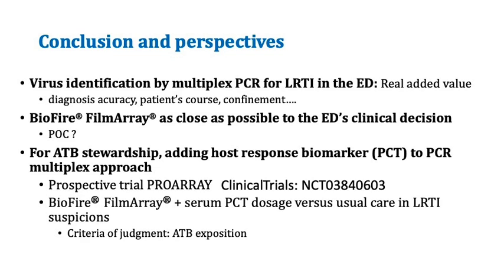So, what are the conclusions and perspectives? First, virus identification by multiplex PCR for LRTI suspicion in the ED is a real added value because of the diagnostic accuracy, because of its involvement in the patient's course, and because of confinement decisions.